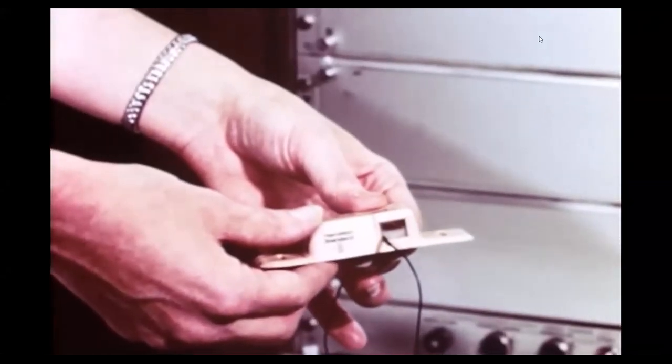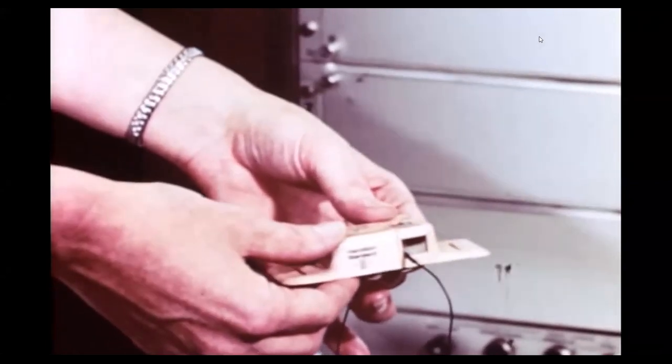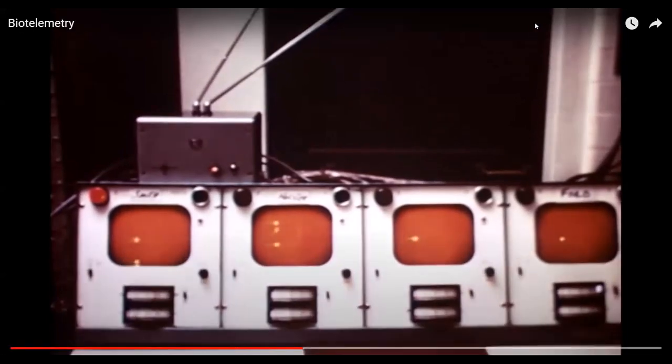This is a commercial model of the transmitter. It weighs just over 1 ounce. Short wires are attached to electrodes which are pasted on a patient's chest. Here is a prototype of the commercial FM receiver. Several receivers can be set up at intervals of 100 feet to relay signals from the transmitter to an oscilloscope bank, seen here at a New York City medical center.